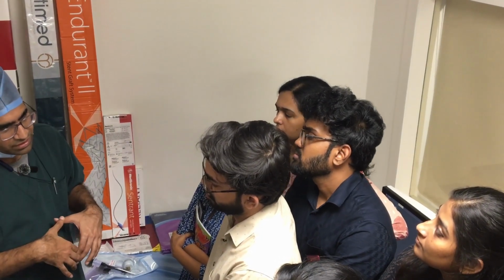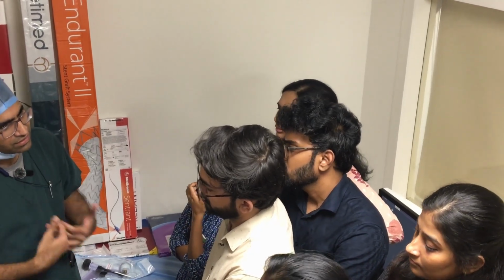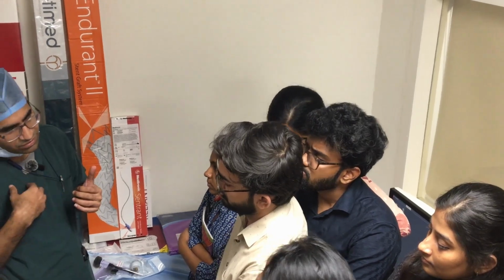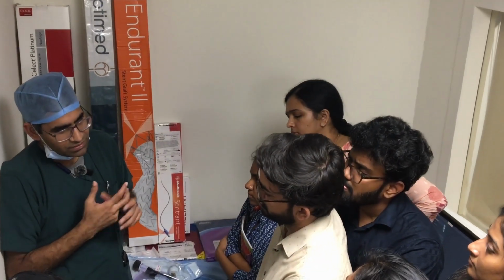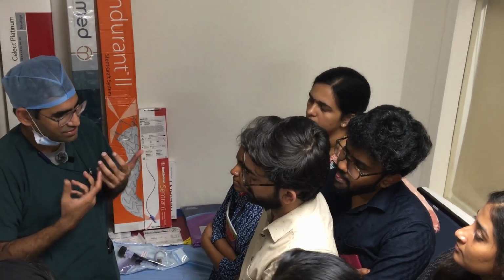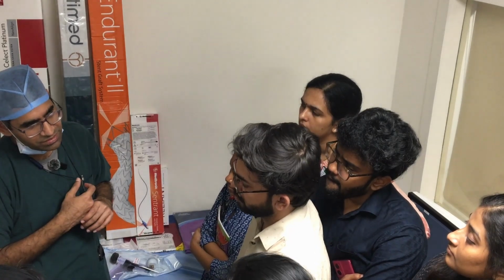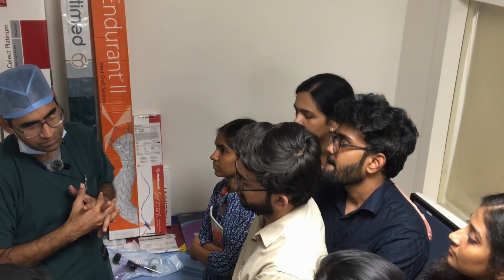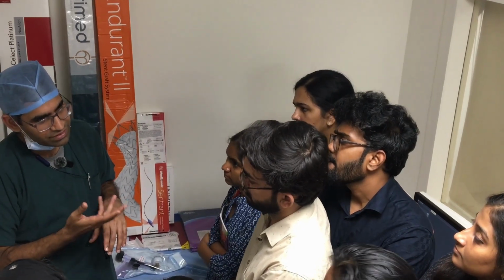For concealed parts of the body, intracranial or inside the chest or abdomen, where you want very precise deployment, you can use balloon expandable stents. So nothing will happen; you can't compress the artery in the abdomen or chest from outside. Use a balloon expandable stent and you'll have a very precise deployment like that. One exception is the aorta, where we use self-expanding.